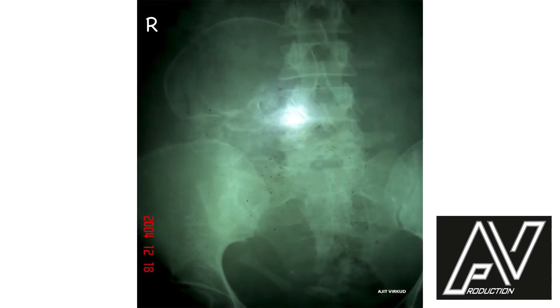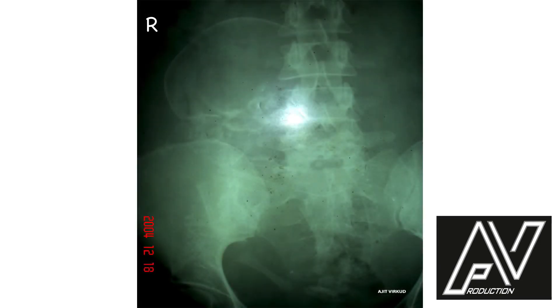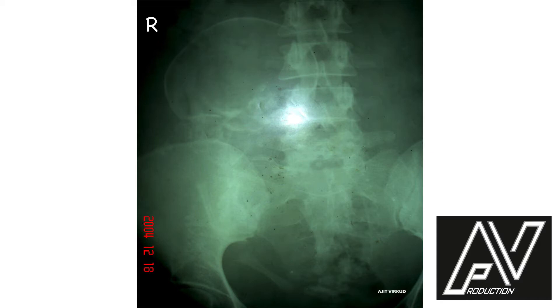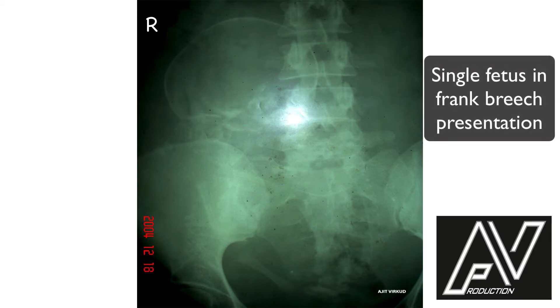This is a plain x-ray of the abdomen and pelvis, AP view, well centralized, well exposed, showing a single fetus in longitudinal lie, flexed attitude. The presentation is breech and the presenting parts are buttocks. The fetal spine is not seen properly because it overlaps with the maternal spine. The head is well flexed. There are no obvious fetal skeletal defects. Therefore, my diagnosis is single fetus in frank breech presentation.